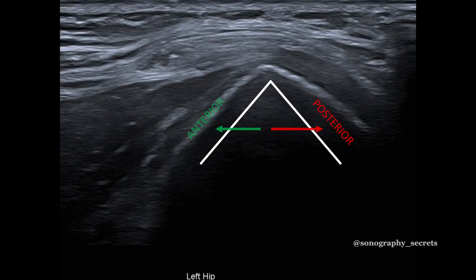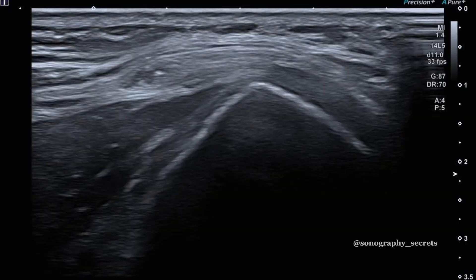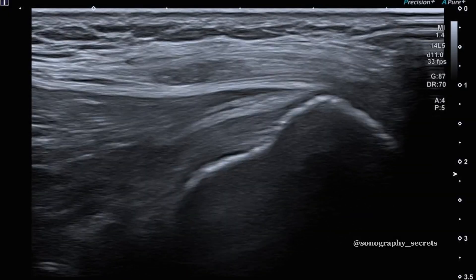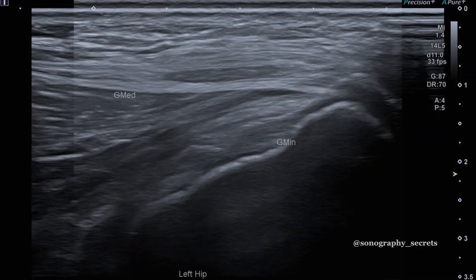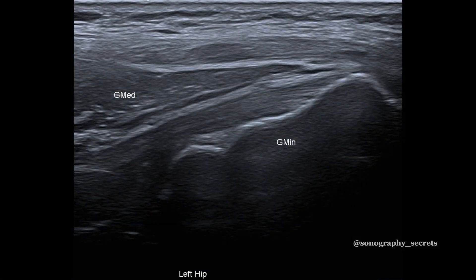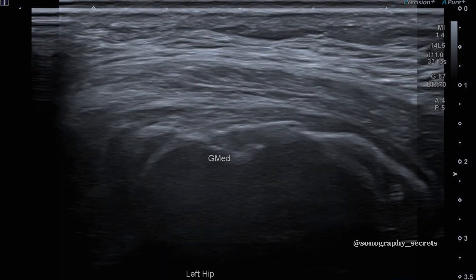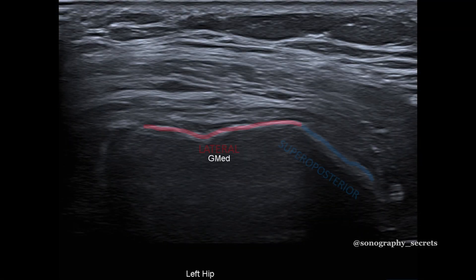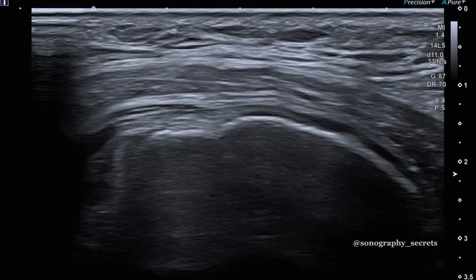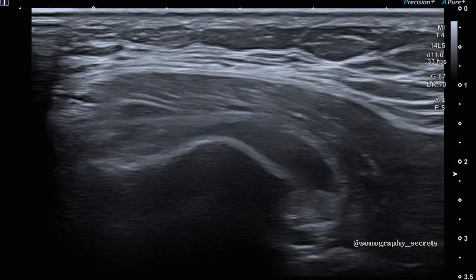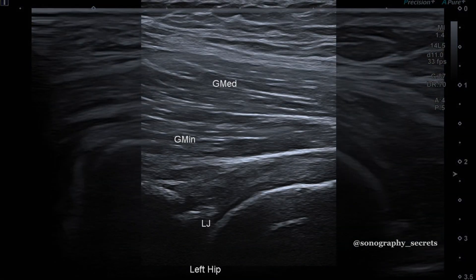Anterior to this peak is the anterior facet and the insertion of glute min. Whilst posterior to this peak is the lateral facet and the insertion of the anterior bundle of glute med, and the posterior superior facet, which has the insertion of the posterior bundle of glute med.